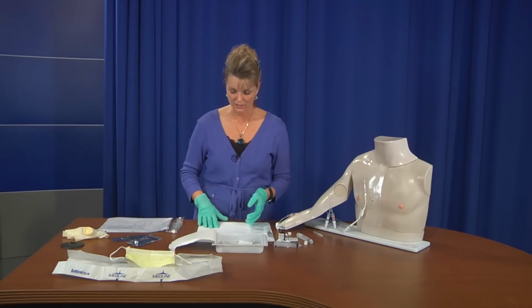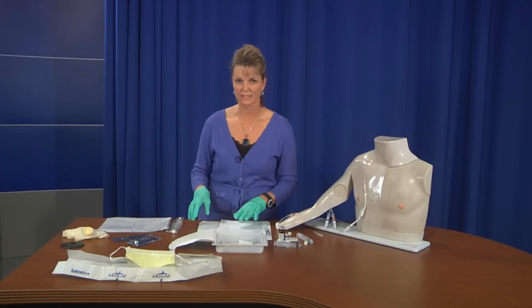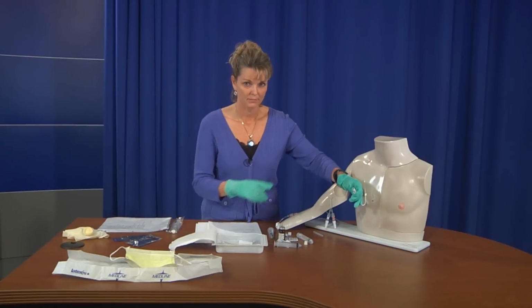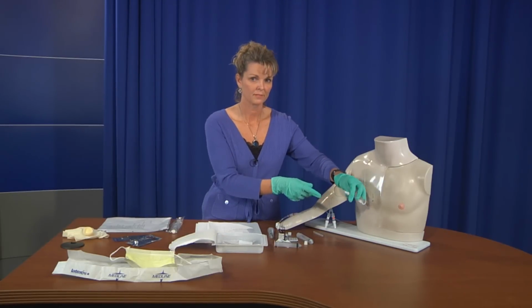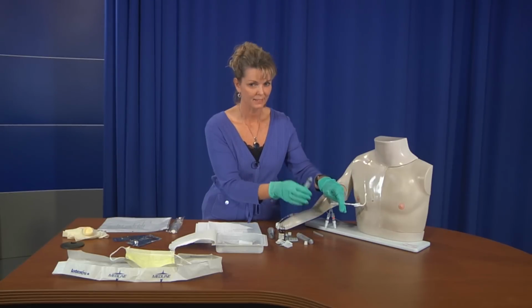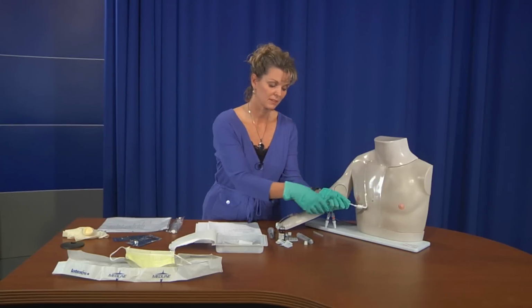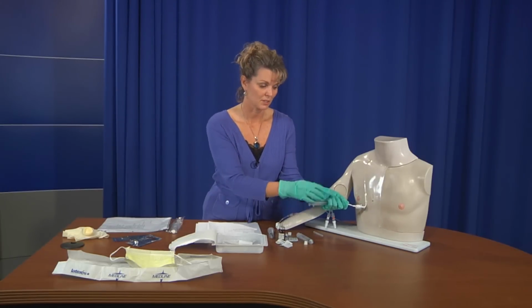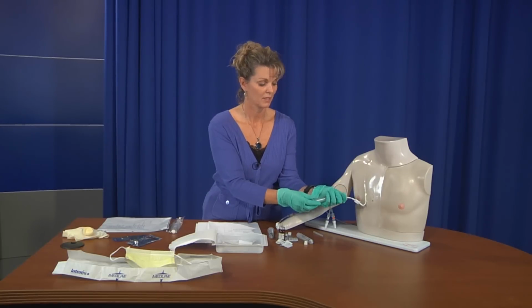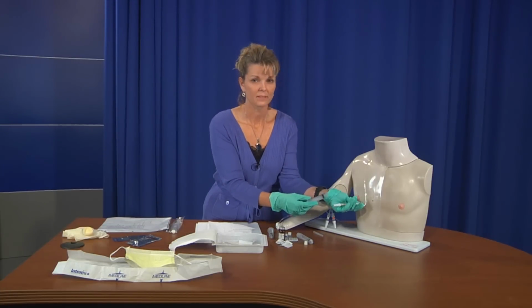As far as the medication is concerned, make sure you've checked your orders, make sure you have the right dose, right patient, right time, your 6 rights. You clean the port 10 to 15 seconds, put your flush on. We want to check for patency. A lot of people forget to do that, but the first thing we want to do is check for patency. So once you've unclamped it, you check for patency, which is nothing more than just trying to see blood. Okay, we want to see if you're going to get blood draw. Once you do that, you flush slowly with the saline. Clamp it back.